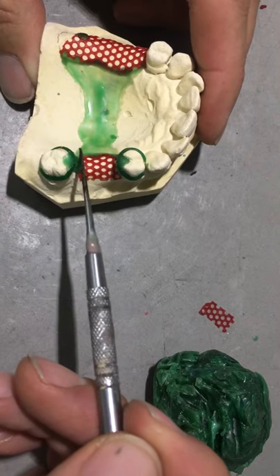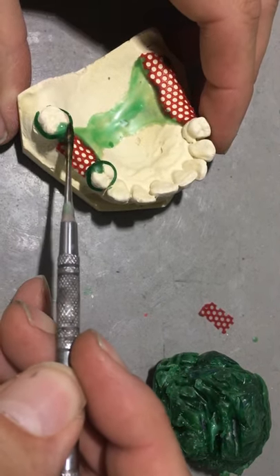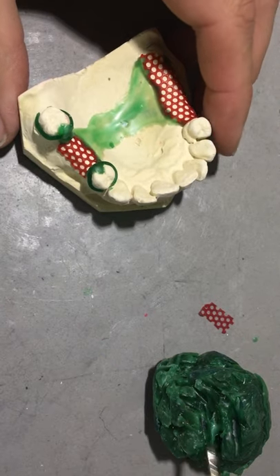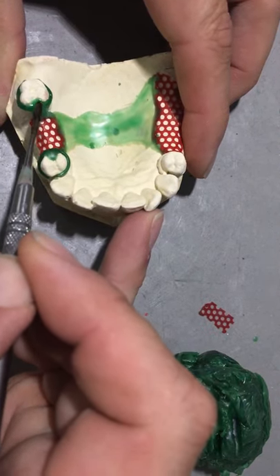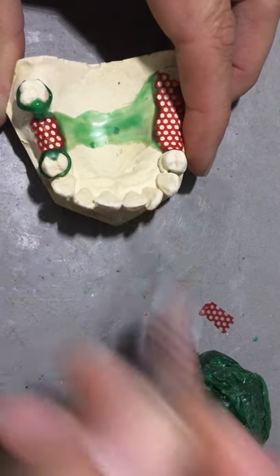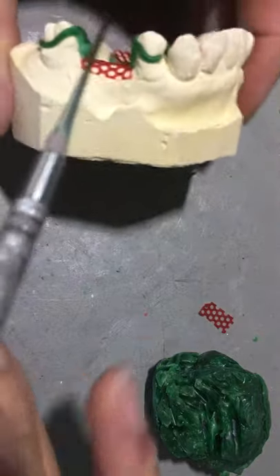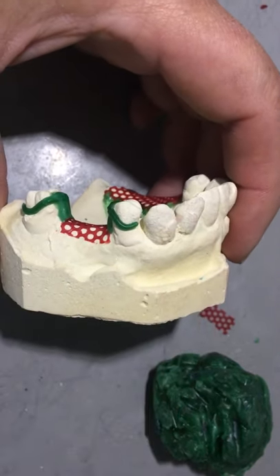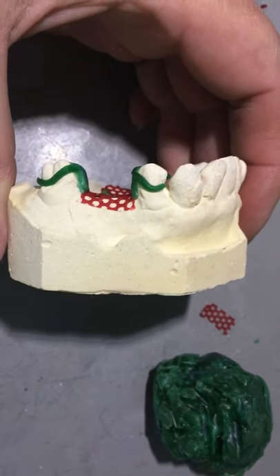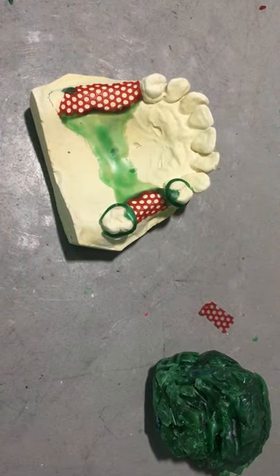So I'm fusing the reciprocal retentive arm together. I'm filling in the prepared rest seat, and also sealing the shoulders of the Akers clasps here with a little bit of wax, buccal and lingual. Then also being cognizant of the thickness of the guide plane, as I've just thinned that down.